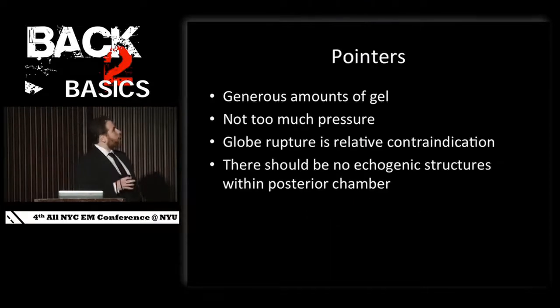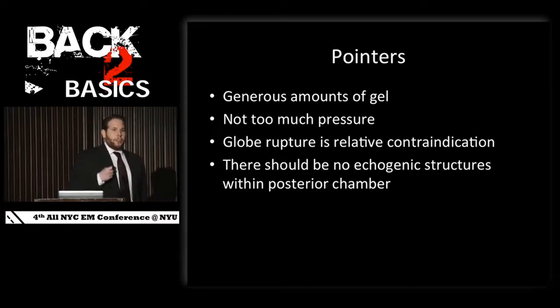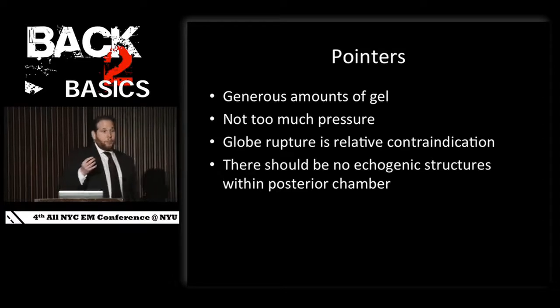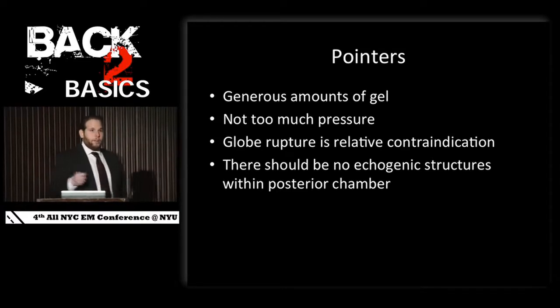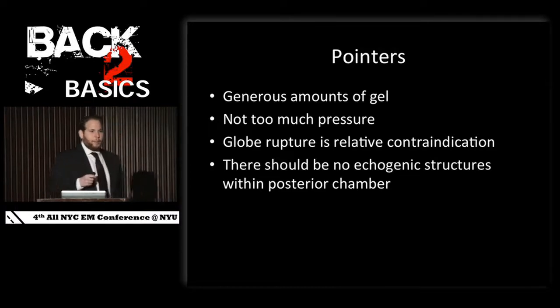So just before we go on to how you're going to use this in the clinical setting, some quick pointers. Lots of gel. I can't say this more clearly. You're going to use that gel so you don't have to push on the eye. You know, you don't want to sit there pushing on somebody's eye. First of all, in the setting of trauma, you definitely don't want to be pushing on the eye. It's also uncomfortable. Try sitting there pushing on your eye for a few minutes. Some of you might complain to me later you have a big headache. So you can use that gel so you don't have to push too hard on the eye.